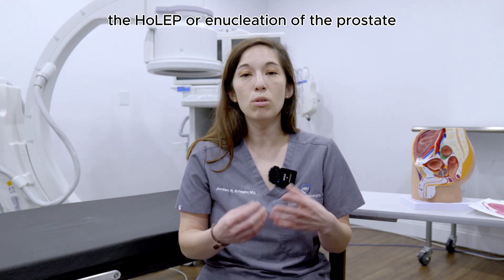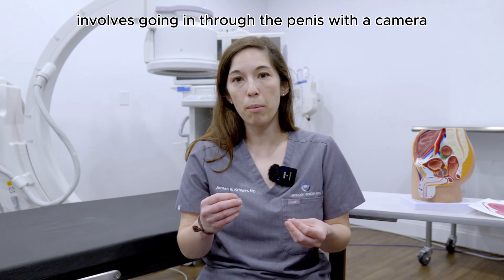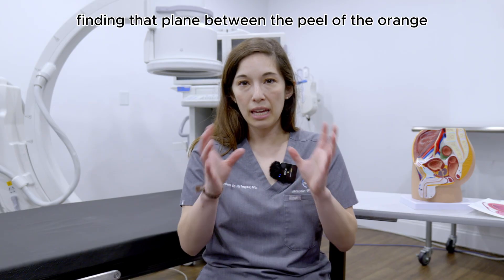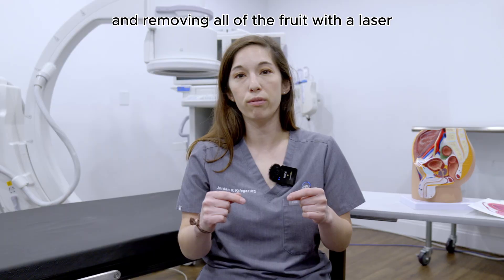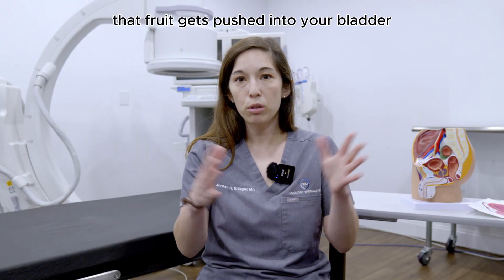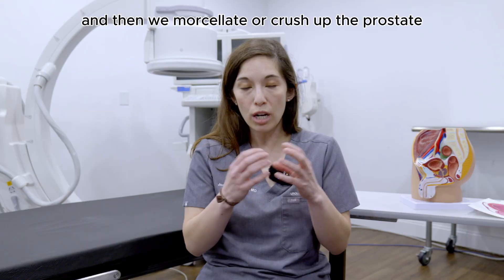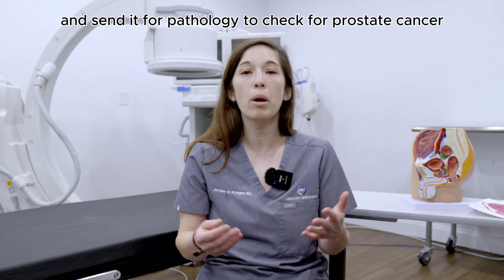The HOLEP, or enucleation of the prostate, involves going in through the penis with a camera while you're asleep under general anesthesia, finding that plane between the peel of the orange and the fruit of the orange, and removing all of the fruit with a laser. That fruit gets pushed into your bladder and then we morcellate or crush up the prostate, suck it out, and send it for pathology to check for prostate cancer.